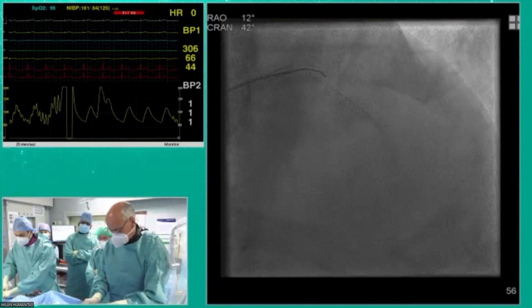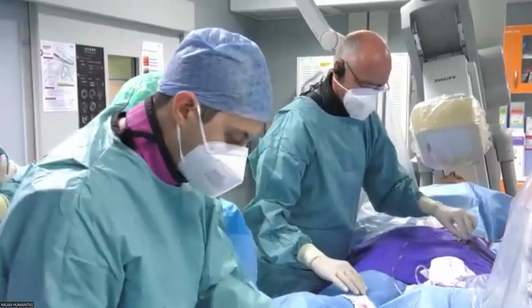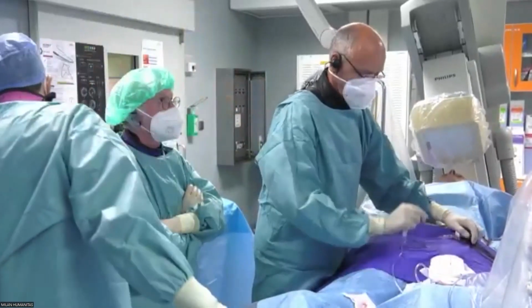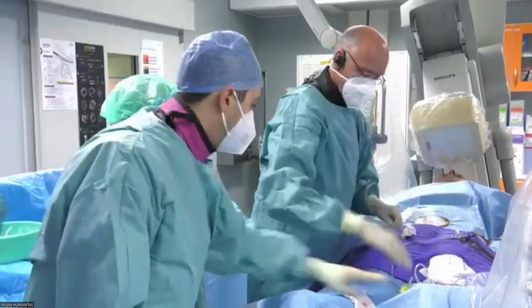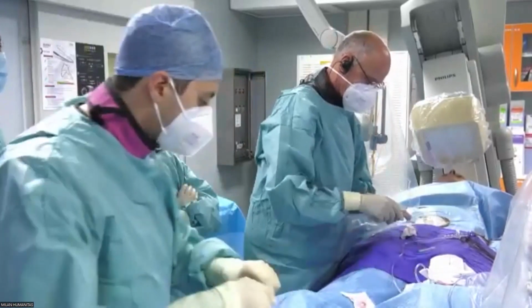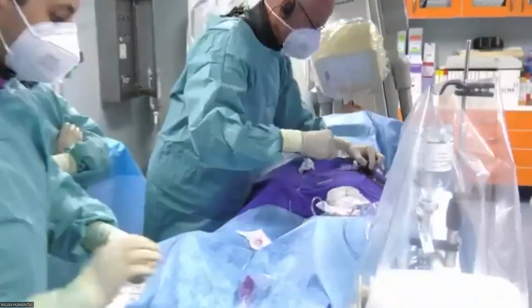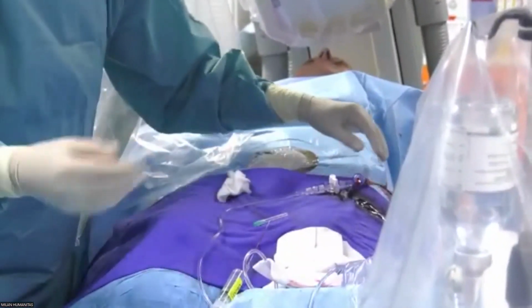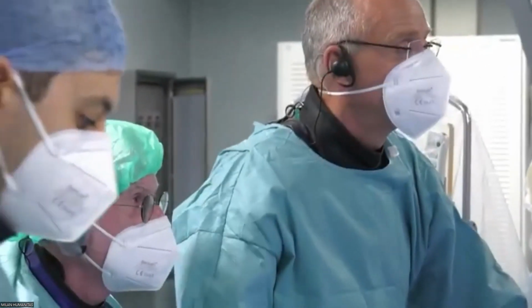Antonio used to come to the Columbia Cath Lab, and so many of his practices, even though he's not there as much anymore, are still there. So relative to other cath labs, we probably overwire branches. I can't say I do septal wiring for protection that often, but if it's a big dominant septal, I've actually been burned in a case of someone else I know with a septal. So if it's a big dominant septal, there's nothing else I probably would wire.